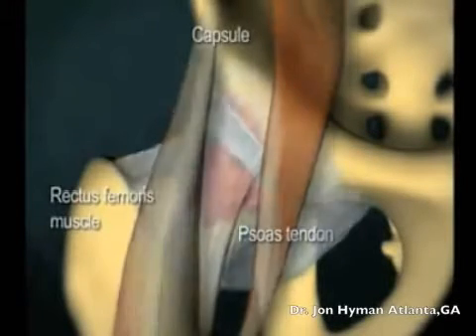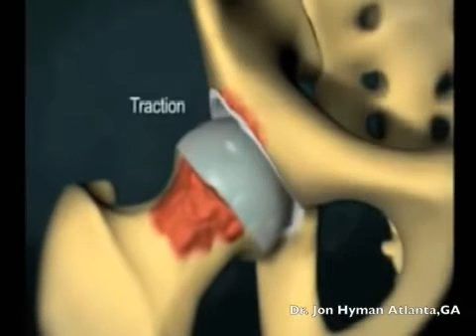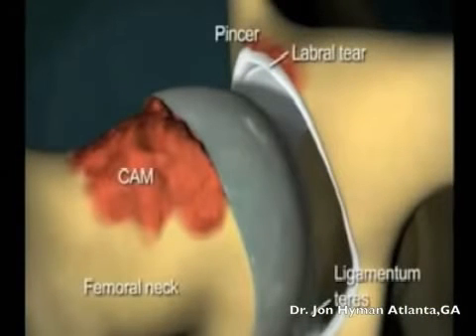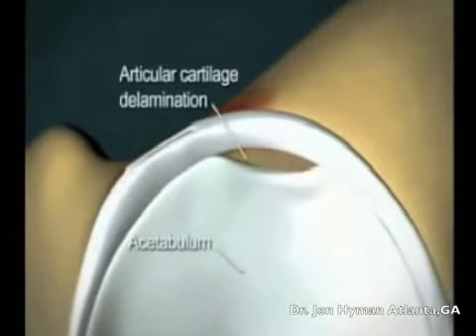Arthroscopic impingement surgery requires axial distraction of the joint. The traction that is applied provides space between the femoral head and acetabulum. This allows for access to the hip joint and treatment of the labral pathology and the rim impingement.